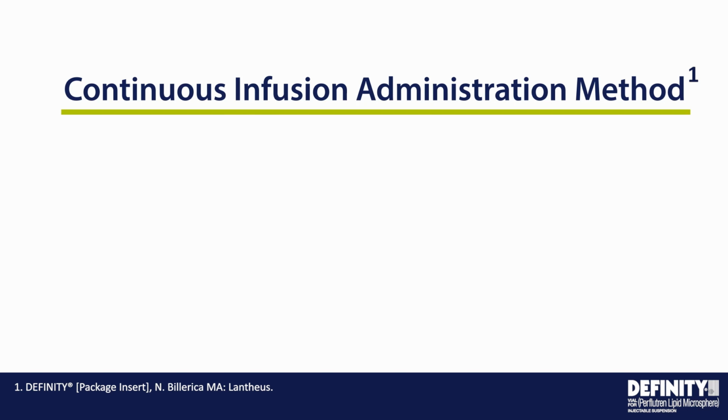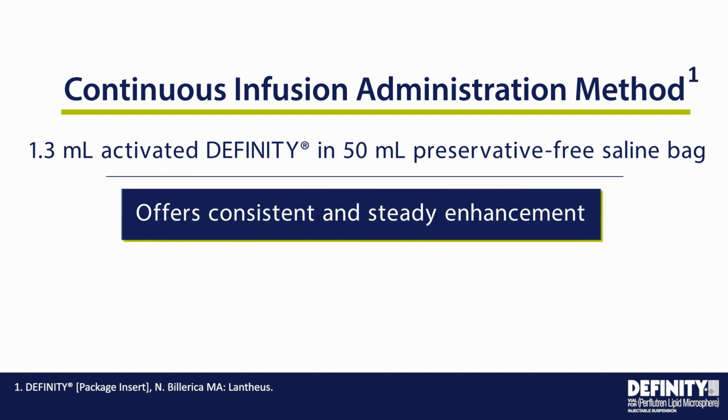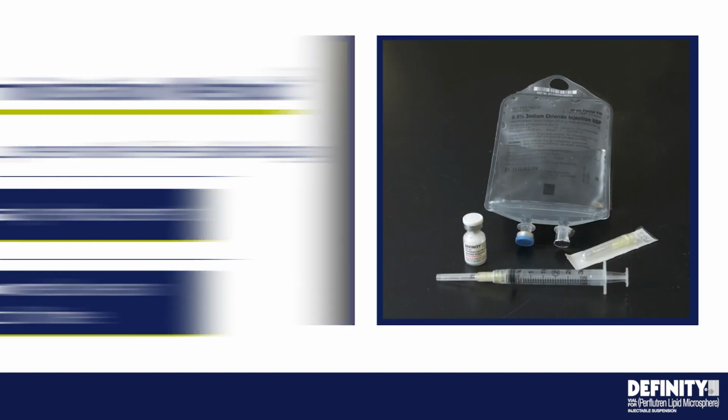The continuous infusion administration method combines 1.3 milliliters activated DEFINITY in a 50 milliliter preservative-free saline bag. This method offers a consistent and steady enhancement of DEFINITY and is well suited for exams which are performed over an extended period of time.